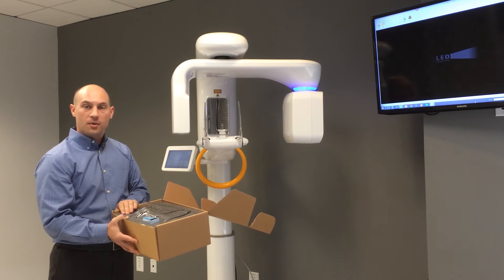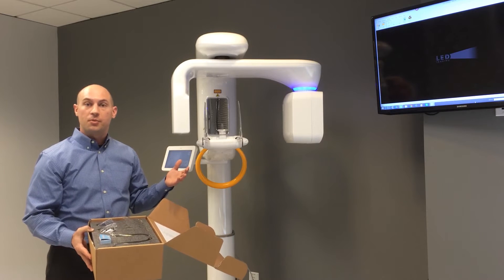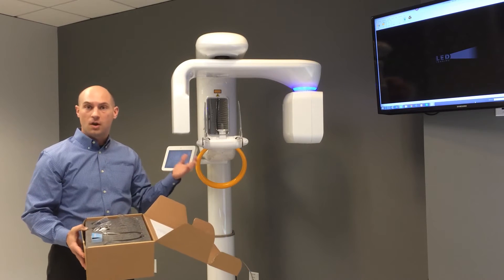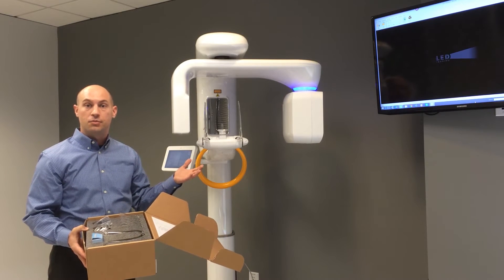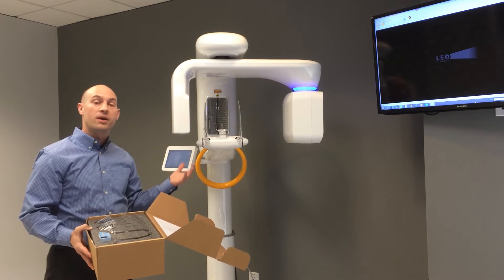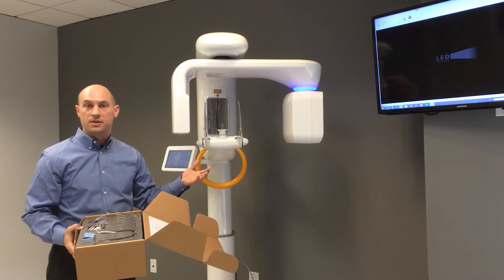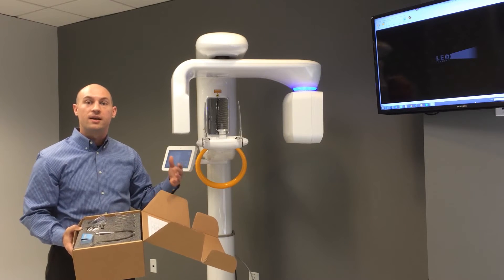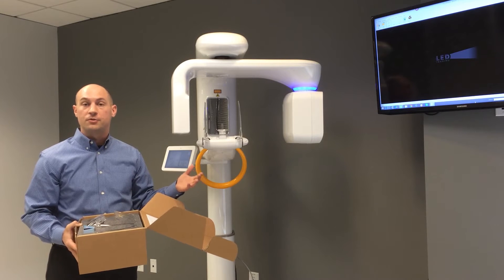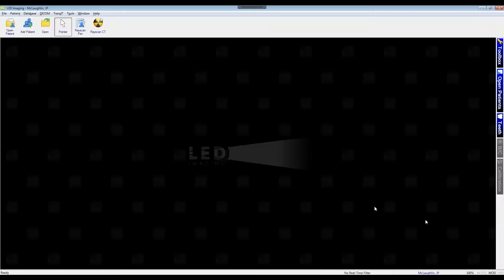Before we actually get our patient into the machine, we want to get the computer side prepared, since the machine is controlled almost 100% by the provided acquisition PC. We want to get that side taken care of first to make sure the patient isn't uncomfortably waiting. So let's move over to the computer side and get ready for a panoramic, cephalometric, or cone beam CT acquisition.